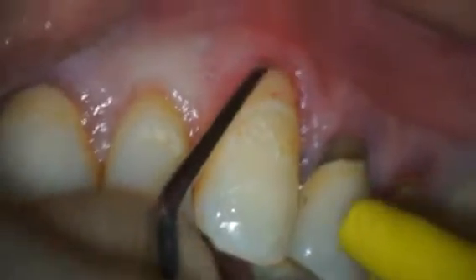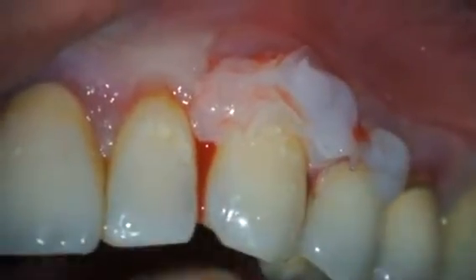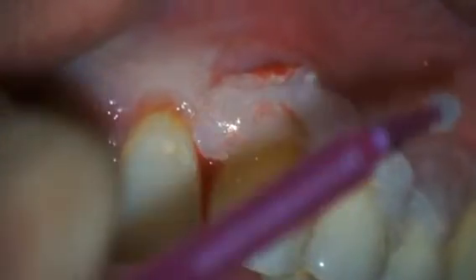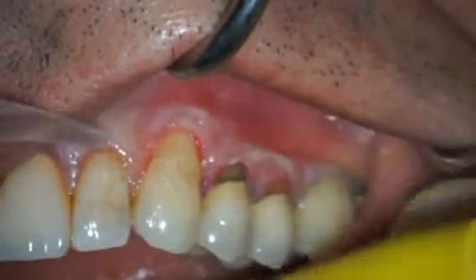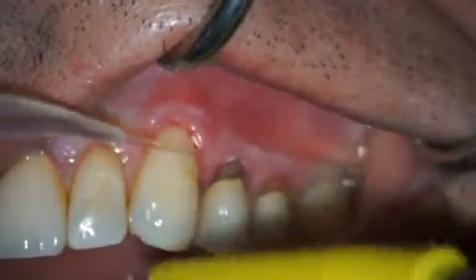Root preparation is completed using manual root planing. The roots are then conditioned for three minutes with 24% buffered EDTA gel in order to eliminate the bacterial smear layer, any root surface toxins, and to expose collagen fibers. EDTA is burnished into the root surfaces to improve its root conditioning effectiveness. The EDTA is then carefully suctioned from the surgical field, followed by sterile saline, which is used to thoroughly rinse the EDTA gel from the surgical field.